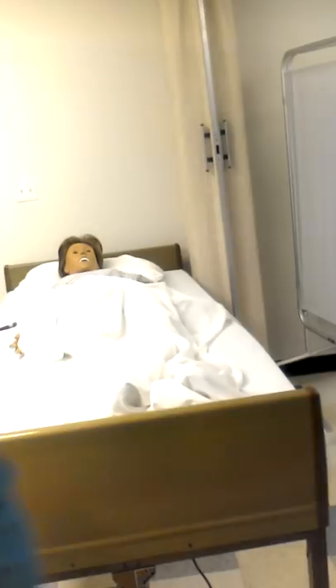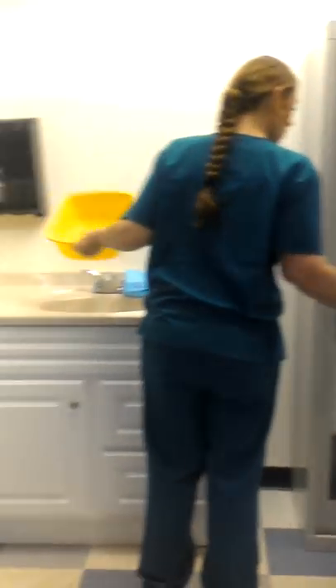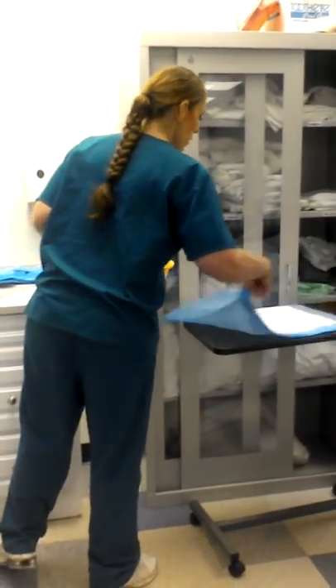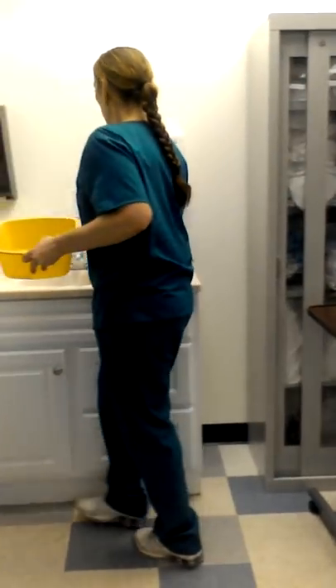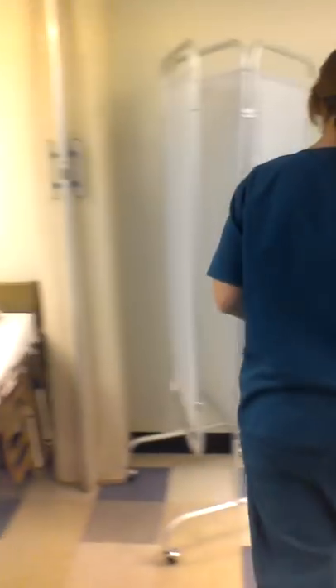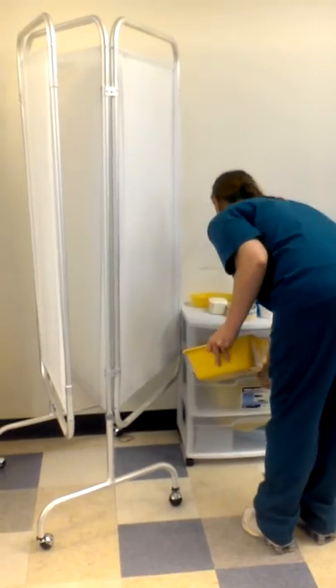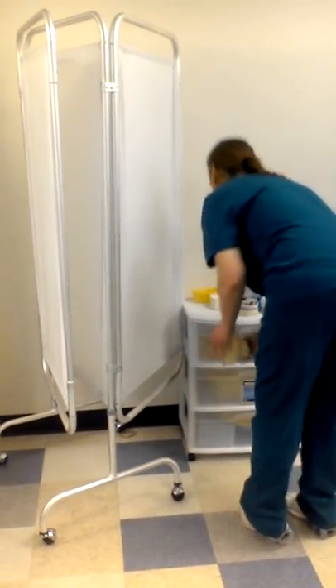This goes in the garbage. This goes in your hamper. This gets rinsed and dumped. Dry. This goes in the garbage. Take the towel. Remove your gloves. Wash your hands.